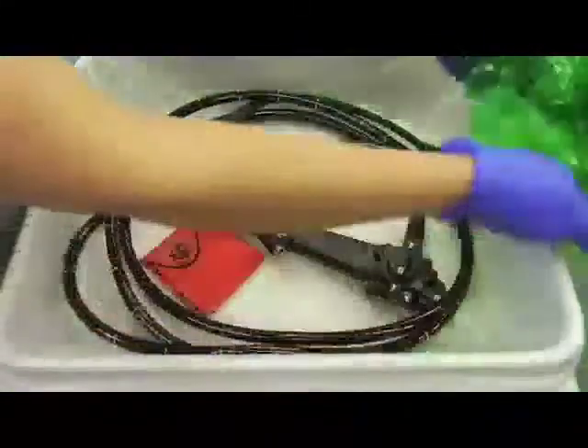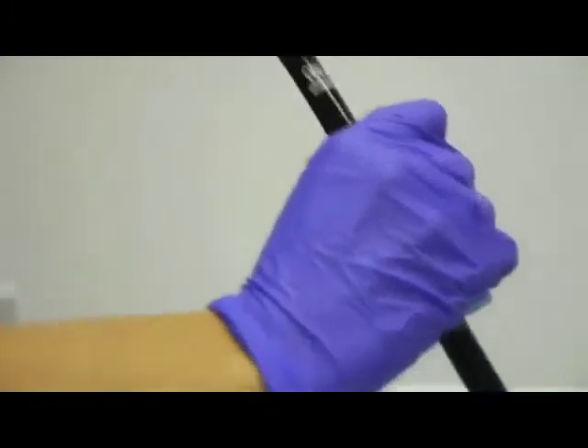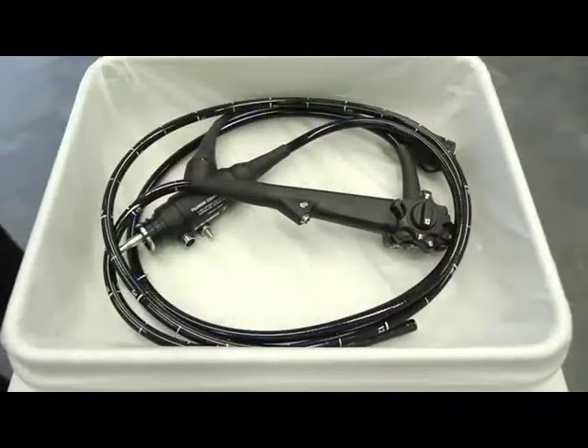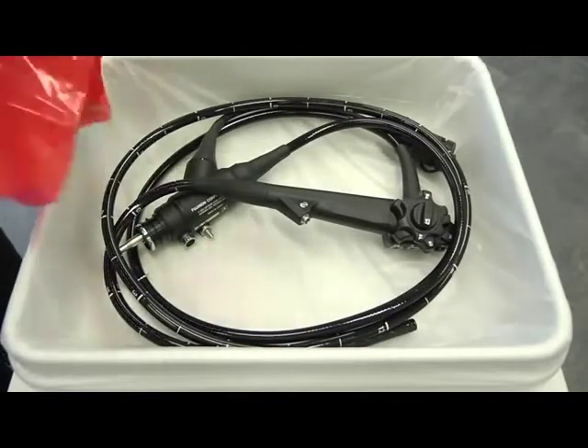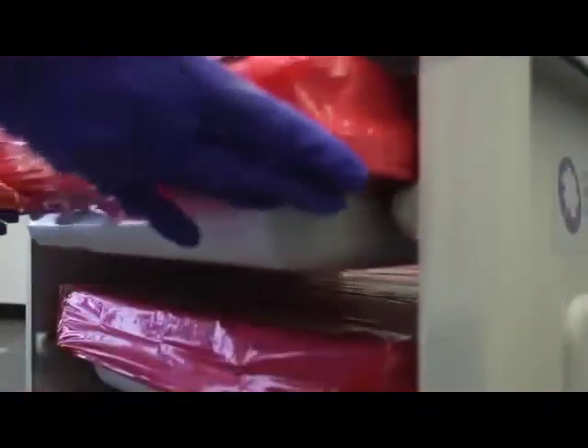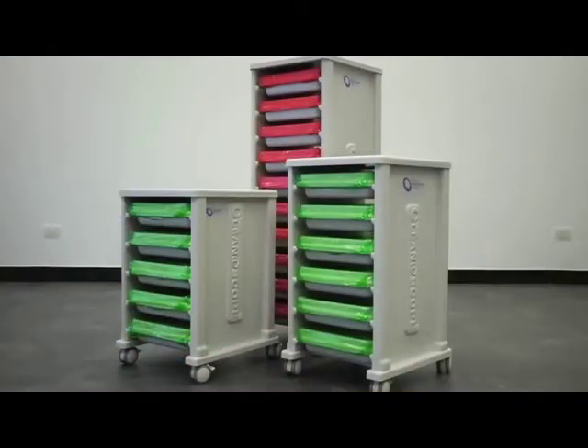To use the equipment, the green cover can be disposed of in regular waste. Following the patient procedure, flush and wipe down the endoscope. Place the endoscope inside the tray and cover using the red cover, which clearly indicates the equipment contained is contaminated and requires reprocessing. Place the tray into your designated Cleanerscope cart to transport the equipment back to the reprocessing area.